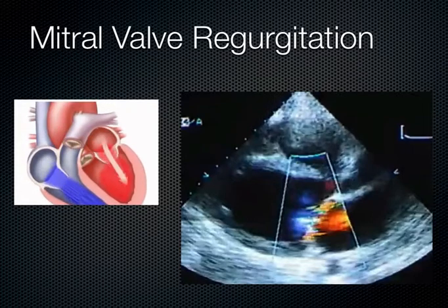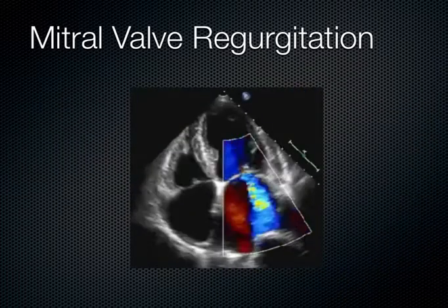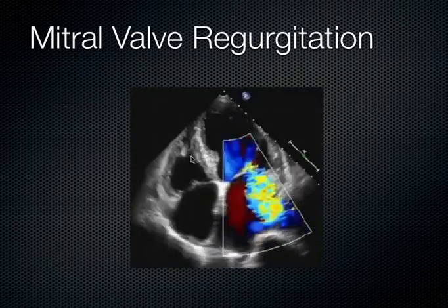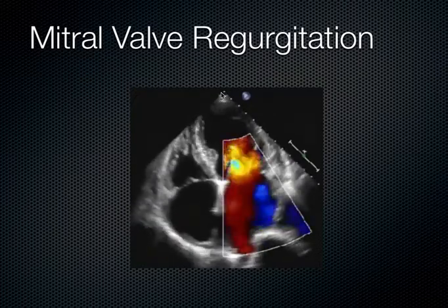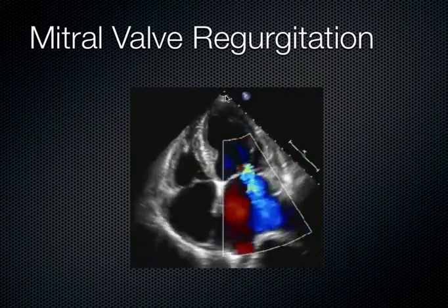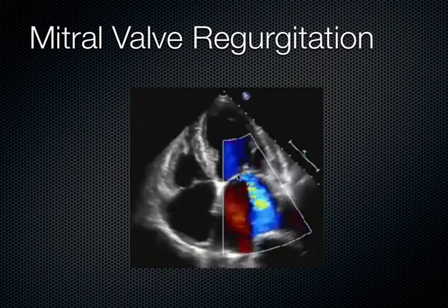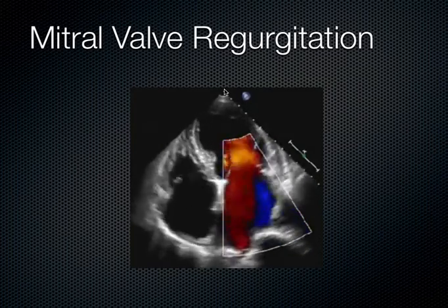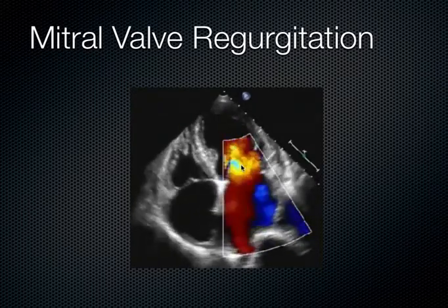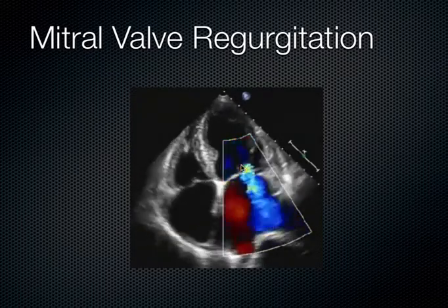Instead, to see a healthy mitral valve or a leaky valve, you use the apical four-chambered view, and I'll show you what I mean by that here. So this is the apical four-chambered view, and we see the LV is here, the RV is here, and the way the sound is aiming, you think about the probe as throwing the sound down the barrel of a gun. What I mean by that is now the flow is either coming up directly towards the probe, more parallel to the sound rather than perpendicular. And that gives you a much more accurate assessment of what's happening with that valve in terms of color flow.